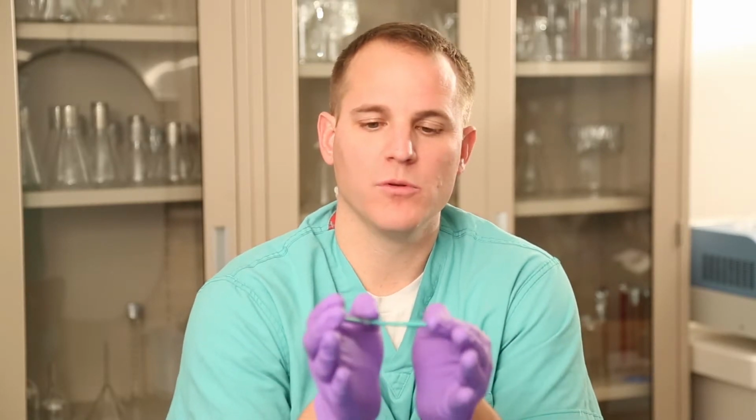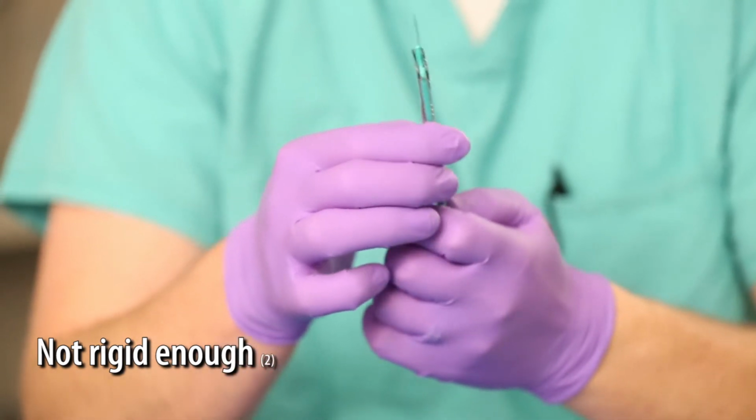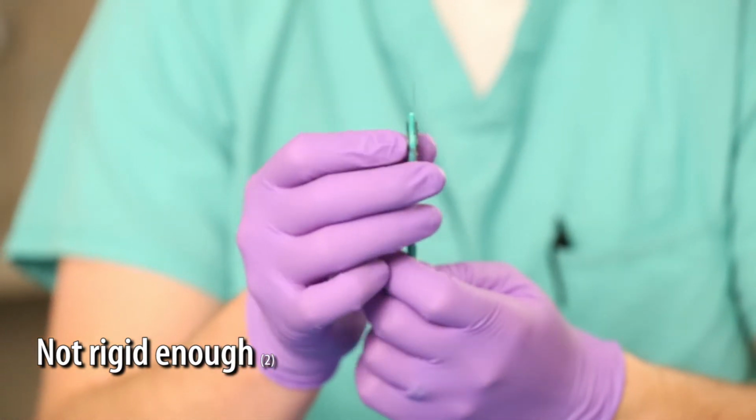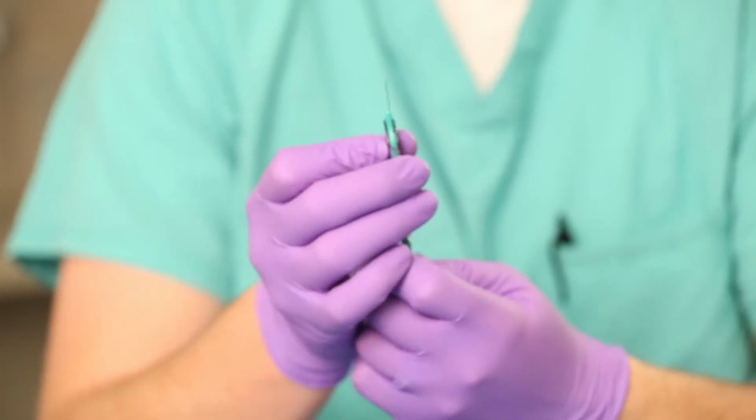Another feature I want to illustrate is the rigidity of the sheath type scalpel. You'll notice that there's quite a bit of flex. When the user is cutting, there is quite a bit of play in the scalpel, which makes these devices less desirable in the operating room.